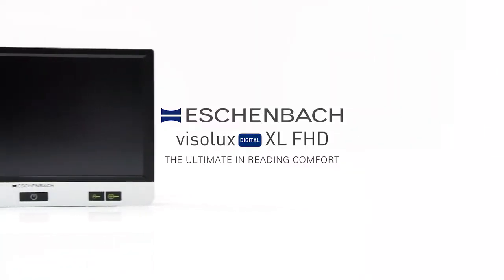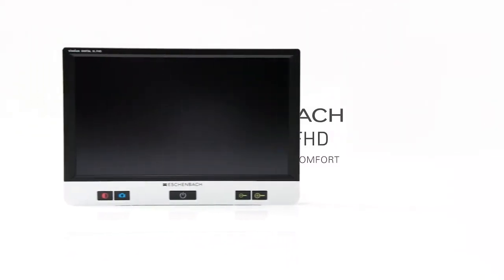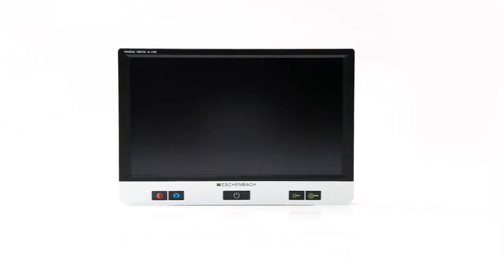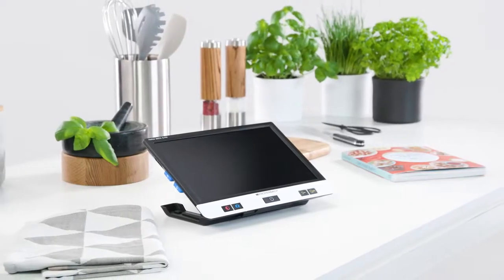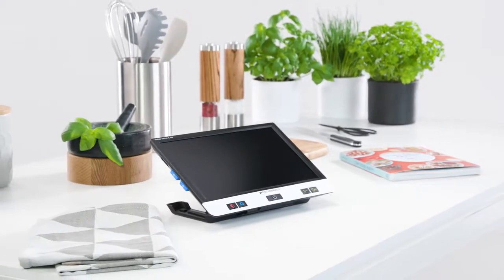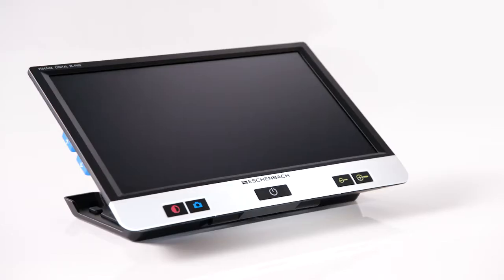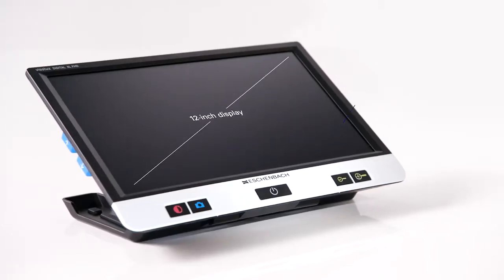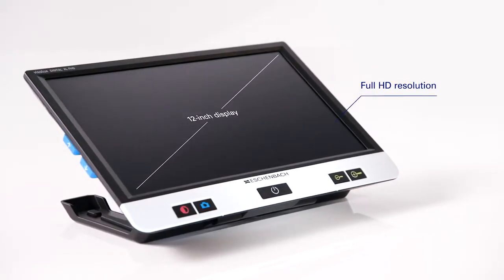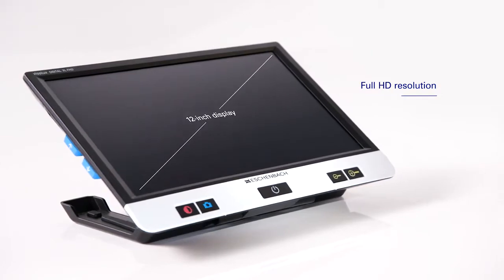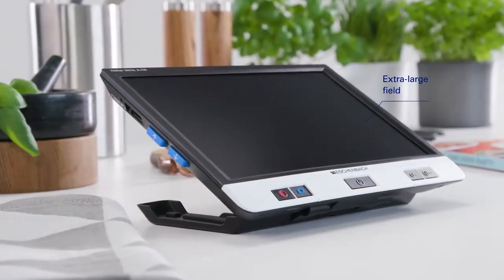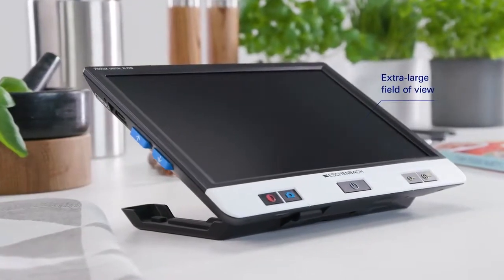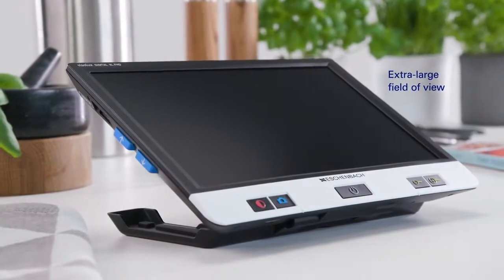The Visolux Digital XL FHD has been developed to noticeably improve the quality of life of people with reduced vision. The digital reading aid offers an extra-large field of view thanks to the combination of a high-resolution display and a special camera.